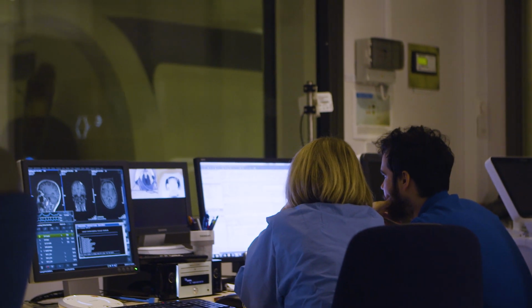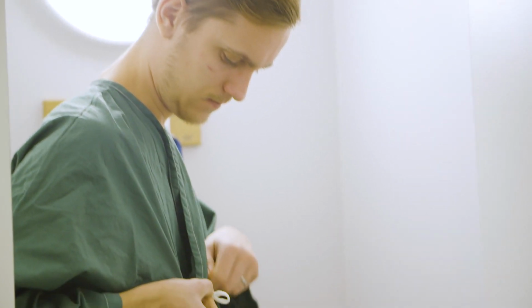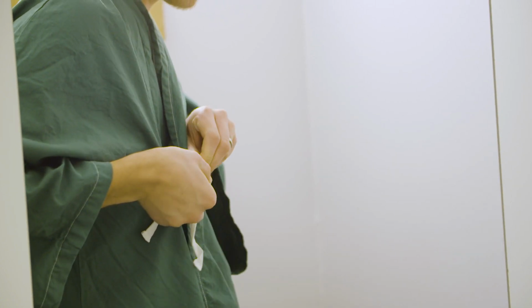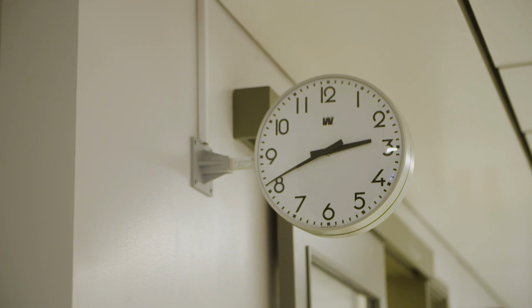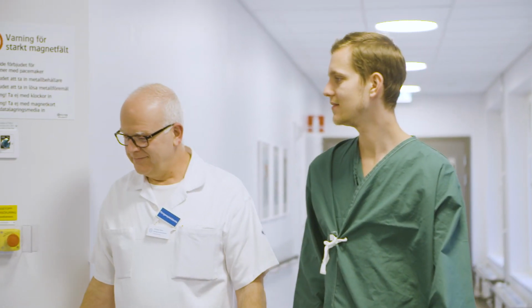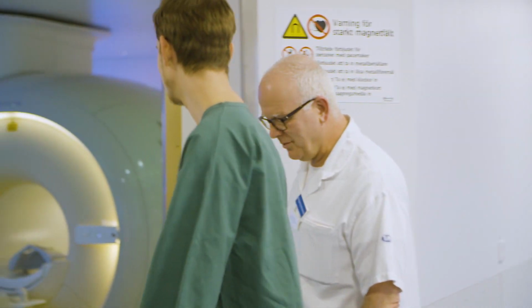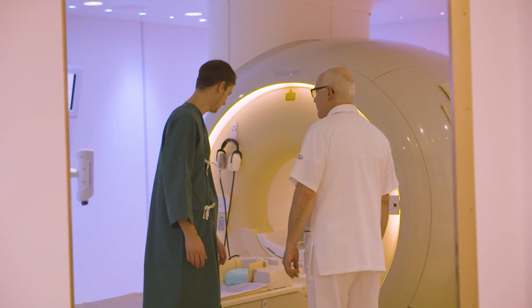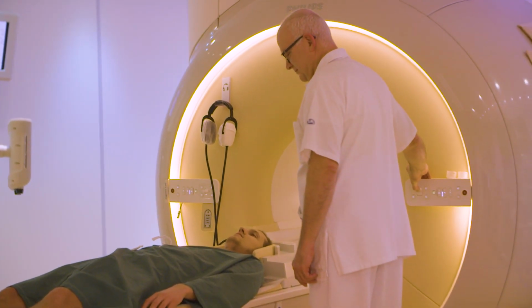And the other benefit is having T1, T2, PD maps. We intend to use that in tumor situations, where if you have a patient with a tumor, we now have the ability to measure T1, T2 values, and if the patient goes through chemo or a treatment regime, of course, if the radiologist is able to visually see the change, that's great.